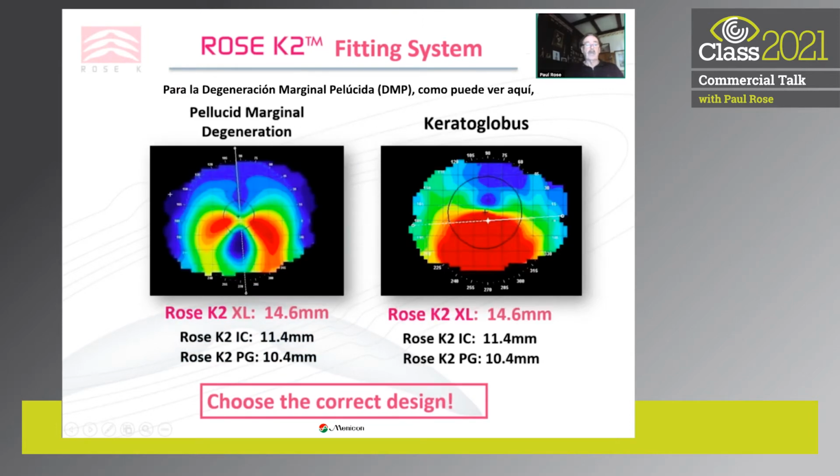For pellucid, you notice here I state XL as my primary first choice. Pellucid is very difficult to fit within the cornea unless it's a very early pellucid case. And in some cases, in early pellucid, you can also use the IC or PG design. In globus, again, I would move immediately to the XL design. To get globus fitting with a corneal design is indeed challenging.